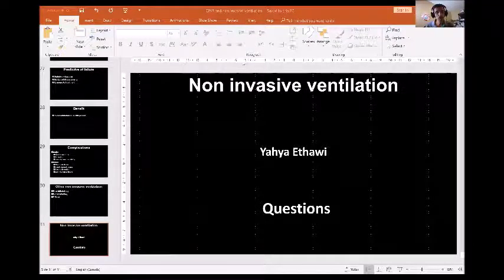Which machine? No, if the CPAP has a compressor itself, it should not be used. A machine with a compressor should not be used. This is only for adults. This is not meant for children. It's too dangerous. Do not use a CPAP machine in pediatrics. CPAP should have pressure from medical air central and oxygen, and use a blender. Never ever use a CPAP getting its own pressure from a compressor inside the machine. That's incorrect. Never do that.